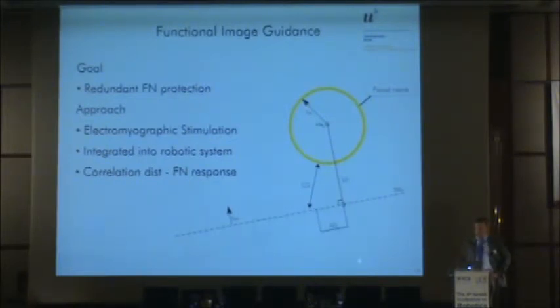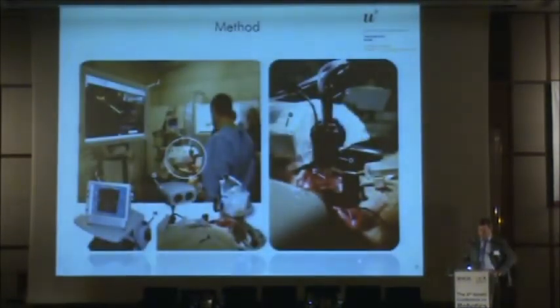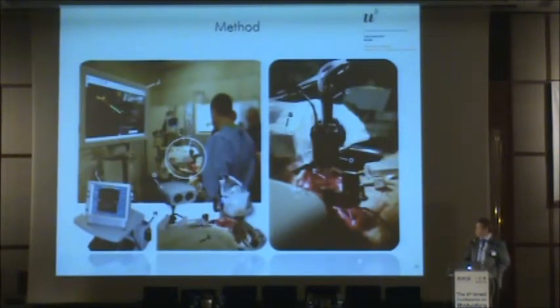And we would like to see what happens in the neural monitoring signal as the signal rises very close to the distance to the facial nerve. This is set up here. We did a couple of sheep. We drilled into the sheep's head several times at different distances to the facial nerve. That was a very extensive study, lots of effort, as you can imagine. You have to have sheep, you have to have a CT and an OR, you have to make sure you keep on with the regulations and so on.